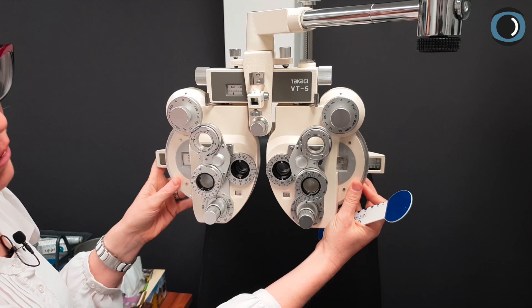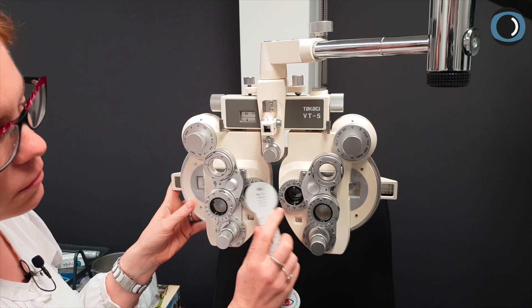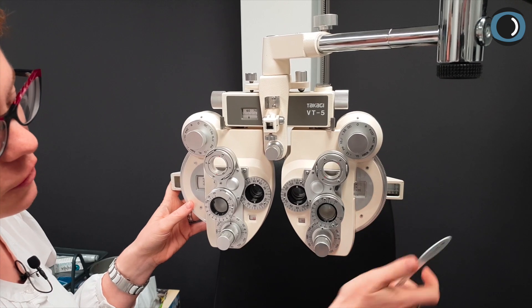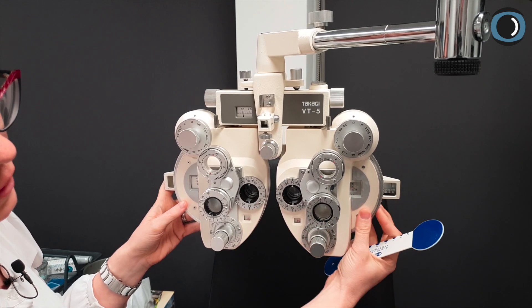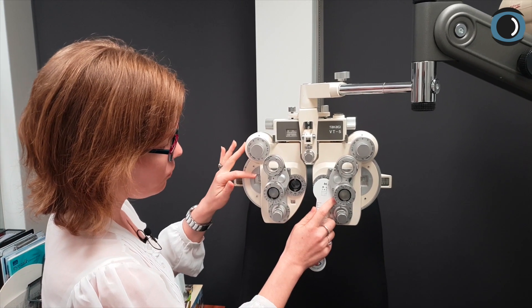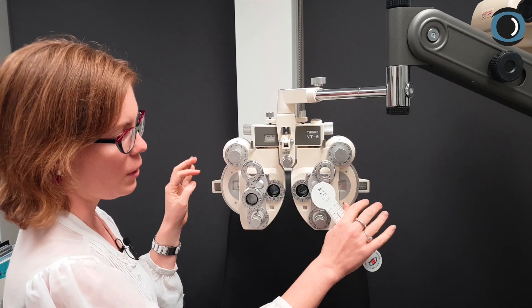Now we need to do the same thing with the left eye. Which do you prefer — right eye or left? He says they're similar, or maybe left. Add plus 0.25. Which do you prefer? Now he prefers his right. Take that last one out and check again. Which do you prefer now? Plus 0.25 in front of the right — left eye. Then we take that last one out and we're balanced.